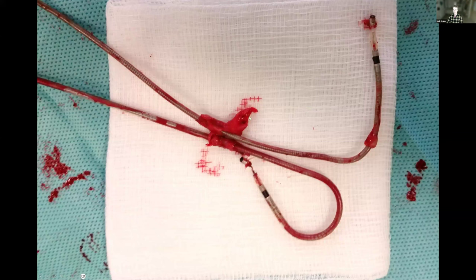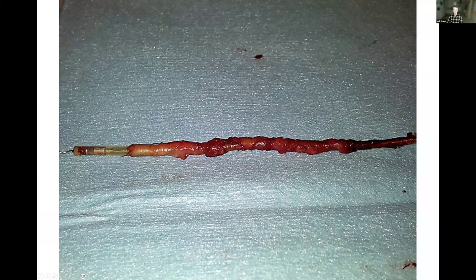Sometimes we are alarmed by what we get out — this is probably a bit of atrium, but thankfully just atrial endocardium has come away with some fibrotic tissue. On the ventricular lead you can see the shock coil with some adhesion, and on the atrial lead the tip electrode has rather come apart in the extraction attempt. With a defibrillator lead it can look like a kebab when you take it out — a big sausage of tissue coming out with the lead — that is how adherent they can be to the heart.